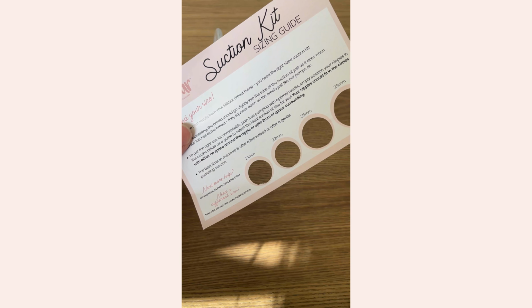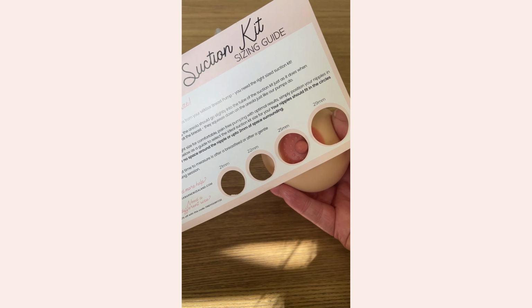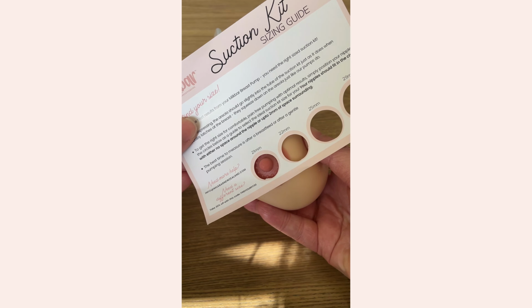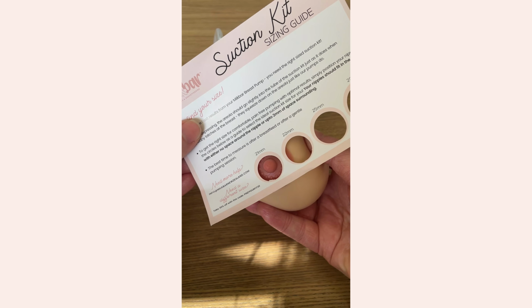Sizing is really important. If your kit is too large or too small, you may not be experiencing the correct level of suction. Use the sizing guide provided with your pump to measure your nipples. Your nipples should take up the entire gap or have a maximum space of 2 mm around. If your nipples are smaller like this one, we do have insert cushions available to purchase to make the tunnel smaller and provide that all-important compression.